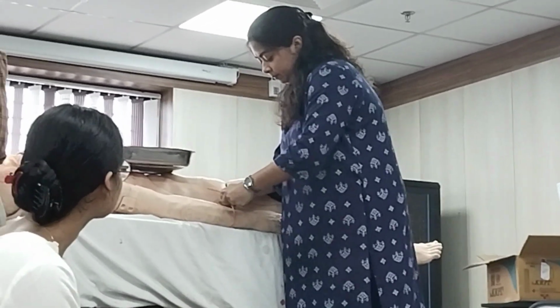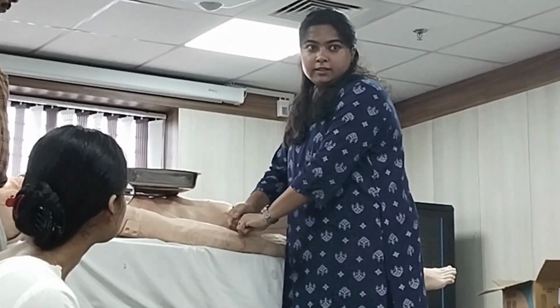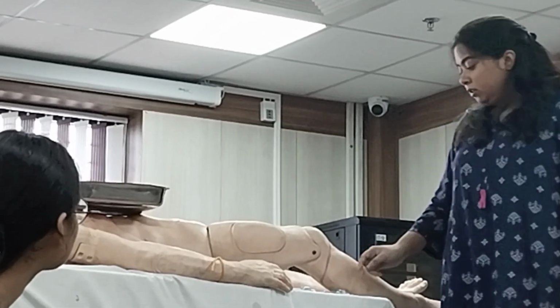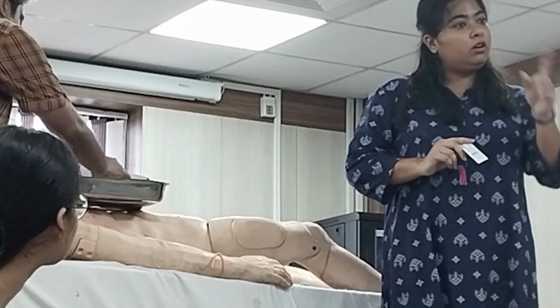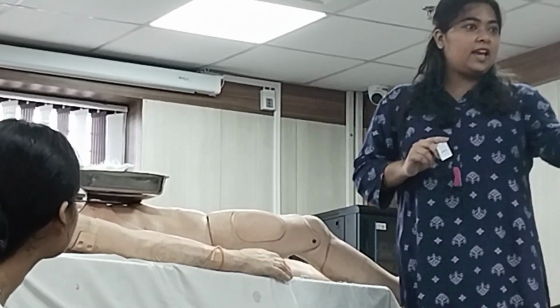You will tie the tourniquet tight enough. Always when you are binding the tourniquet, the most important thing to do is, after doing the procedure, take out the tourniquet. Do not repeat the mistake.